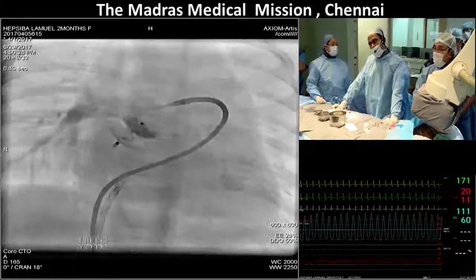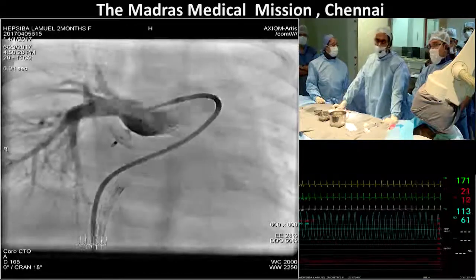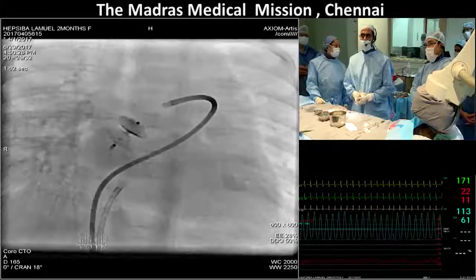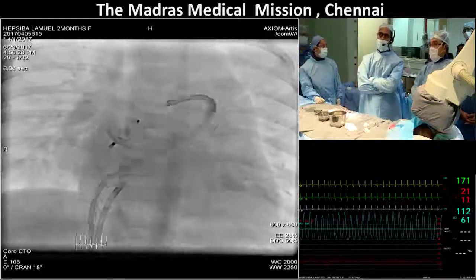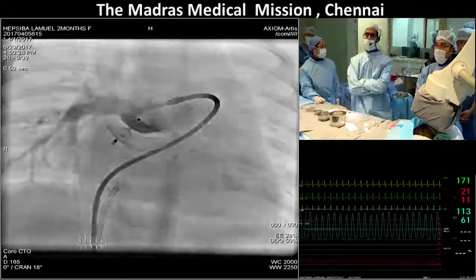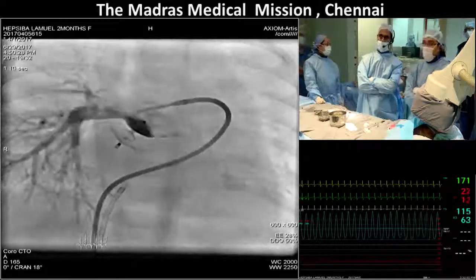And I wonder whether a short course of an anticoagulation for maybe about 6 months or 1 year may be a better strategy. I have personally closed only one before, and that was a little grown-up child, and that did not have an aneurysmal pouch in the left atrium. And so we put in an Amplatzer duct occluder 1 device. It was published in Catheterization and Cardiovascular Interventions many years ago. But this is a pouch that is seen on.